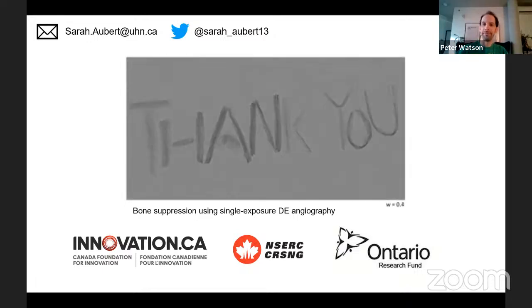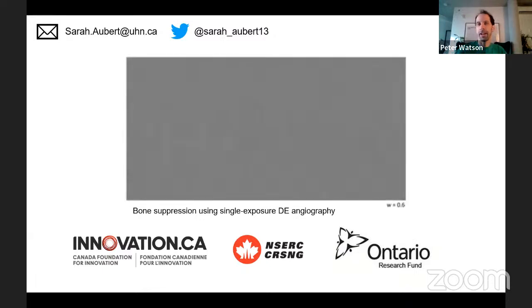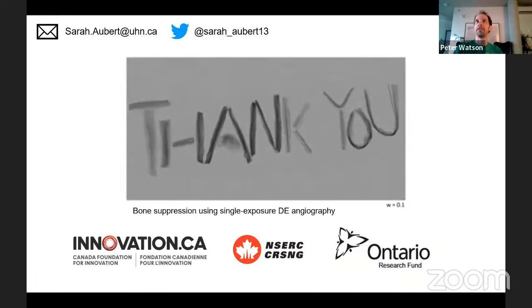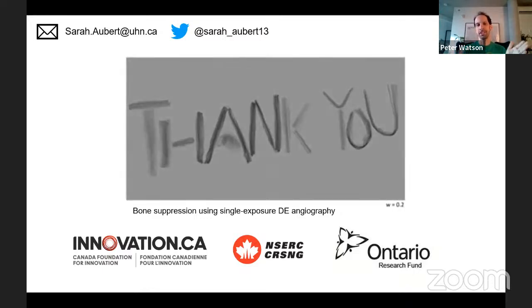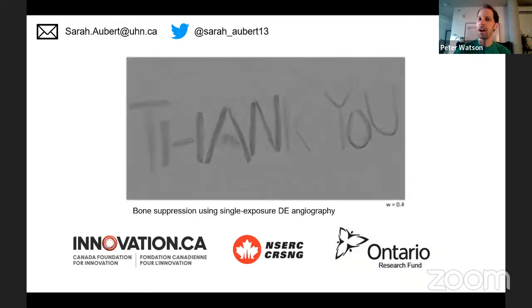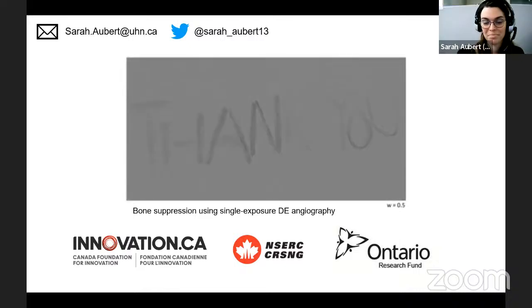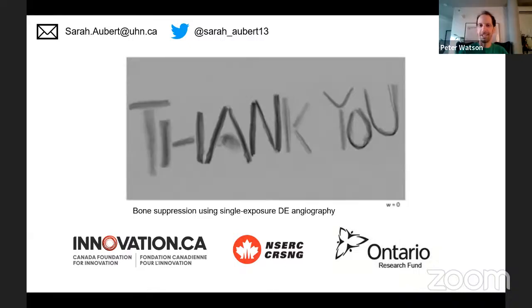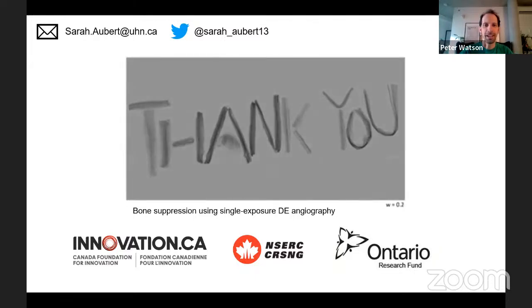Okay. Yeah, I think that was a question I had last time, is that I would assume implicitly that because you have a smaller pixel size and you don't have scintillators and optical blur, you should be getting a higher spatial resolution with your panel, right? Yep. So that's already giving you a boost in the MTF. Nice. Okay.